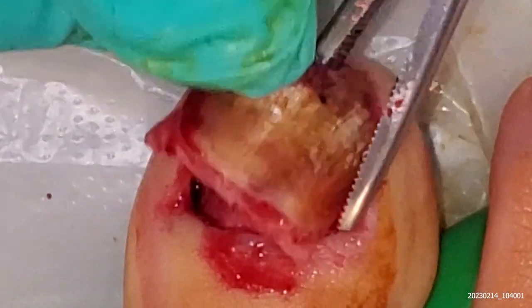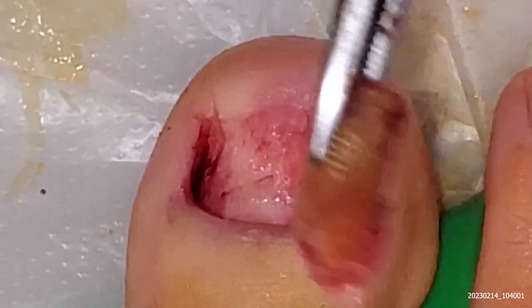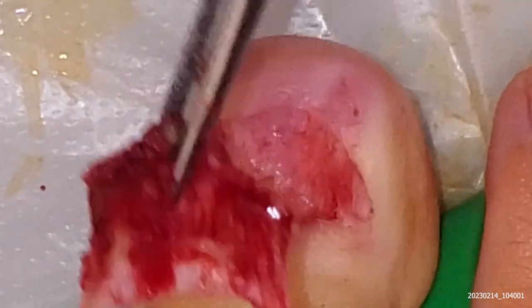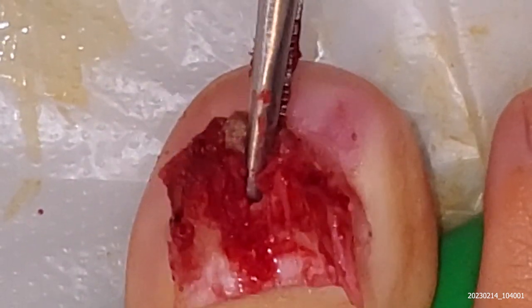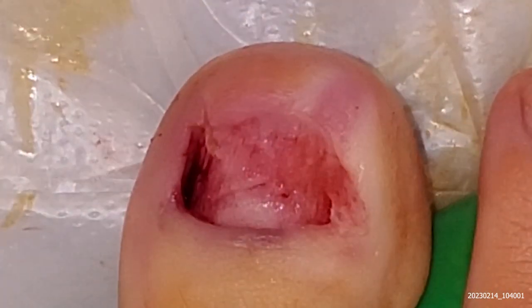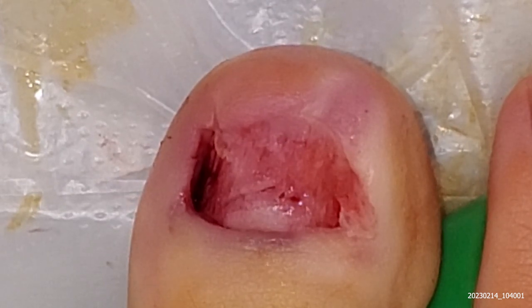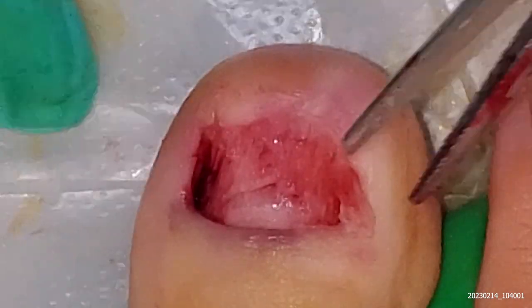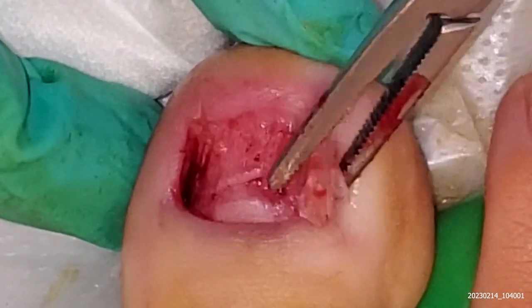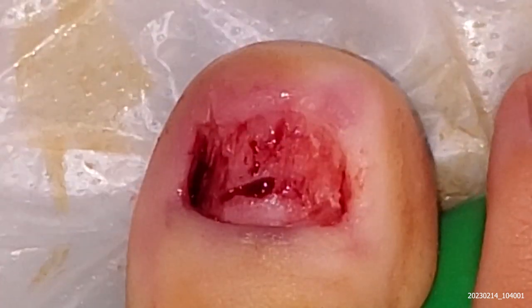It came off in one beautiful piece. There's some damage to the nail bed, but that's the nail — I'll put that aside. I'm just going to clean the nail bed. I have a 15 blade — just going to do some careful cuts to clean everything down.